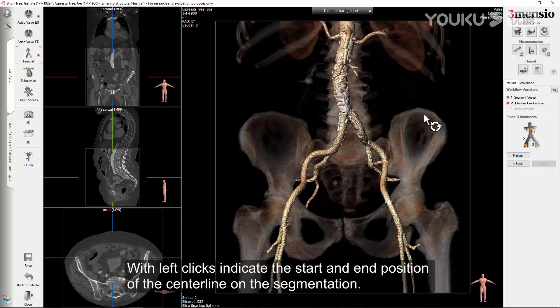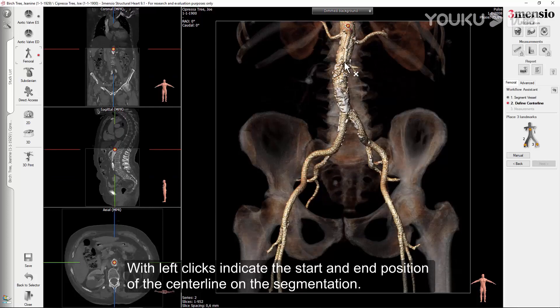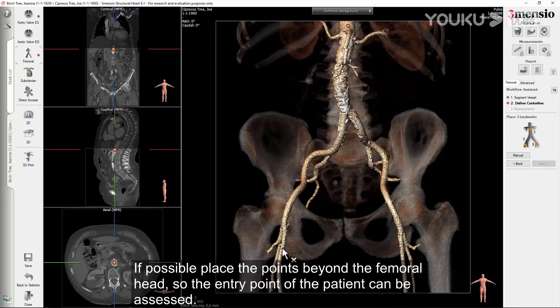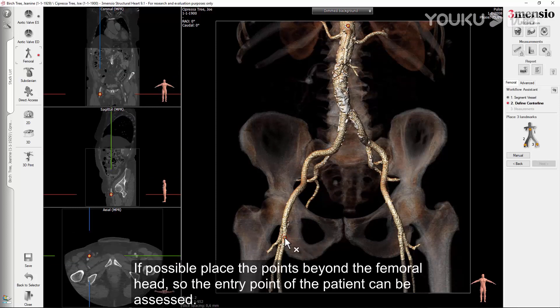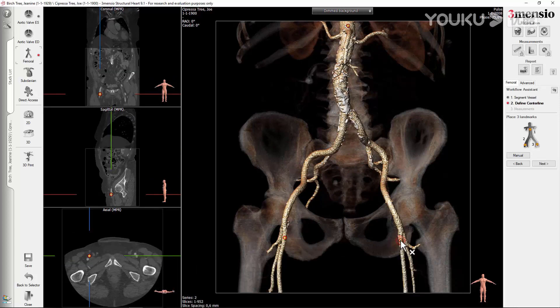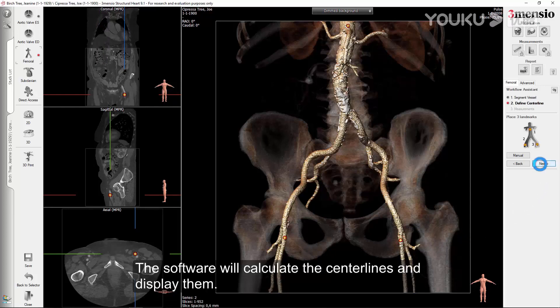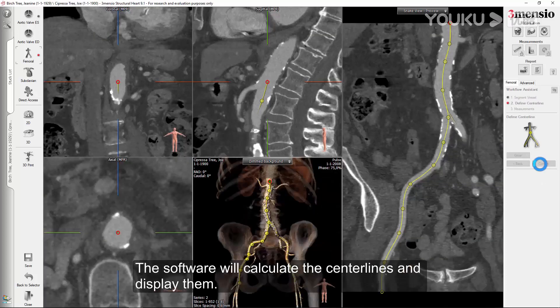With left clicks, indicate the start and end position of the centerline on the segmentation. If possible, place the points beyond the femoral head so the entry point of the patient can be assessed. Press Next. The software will calculate the centerlines and display them.